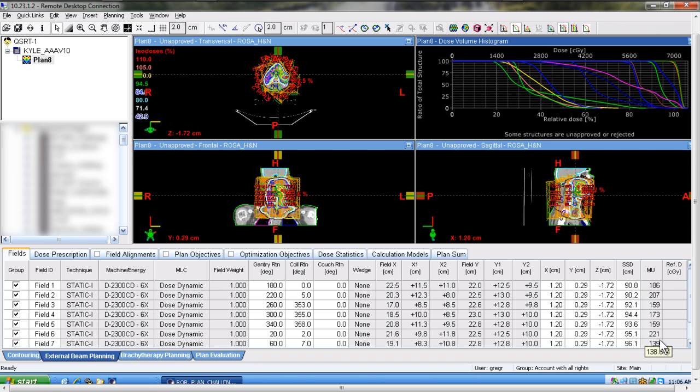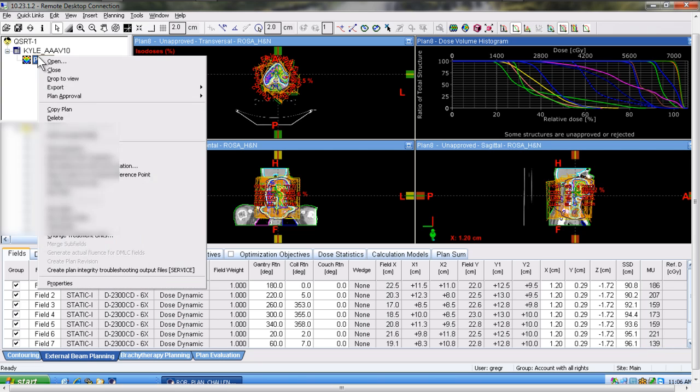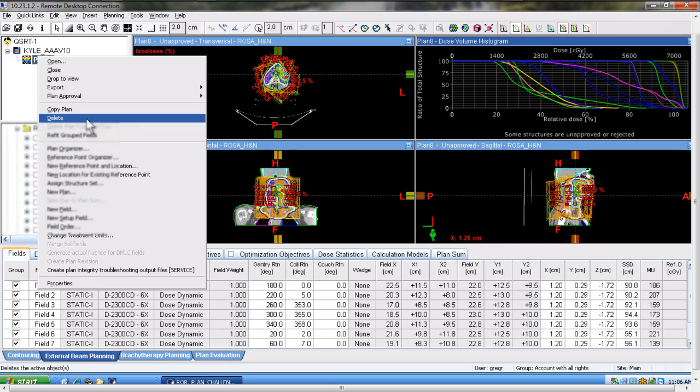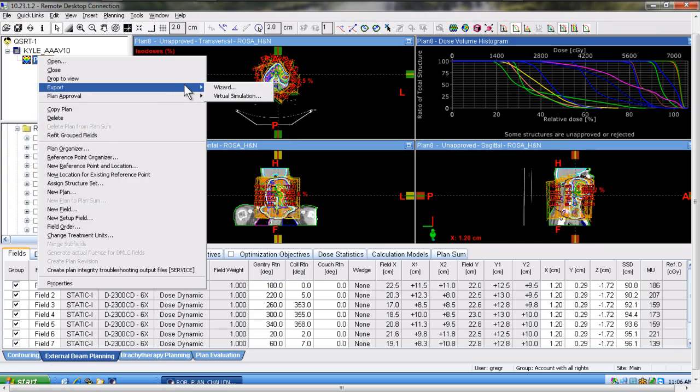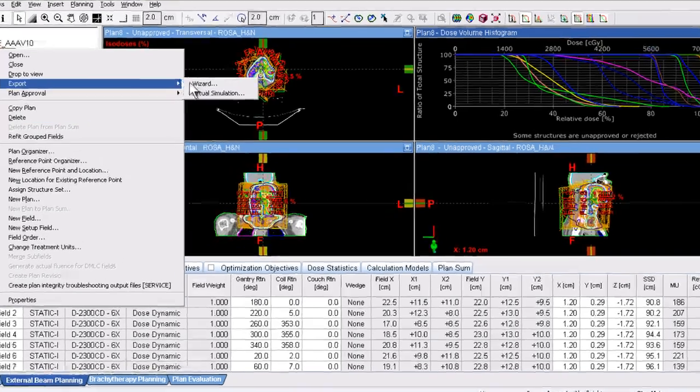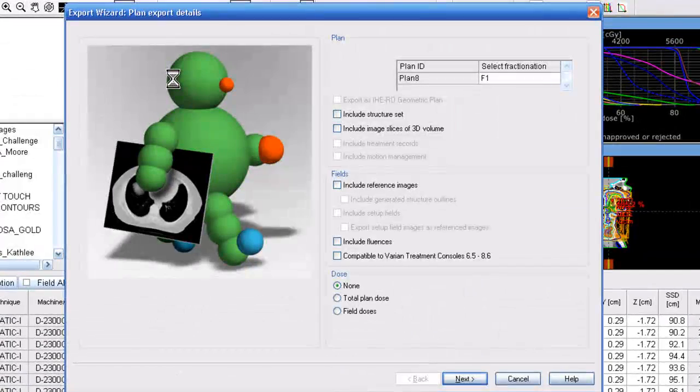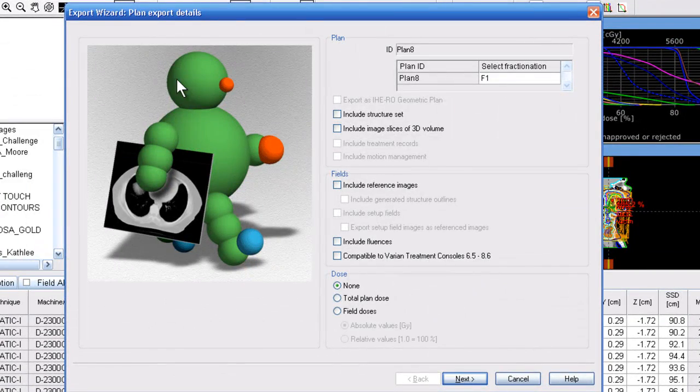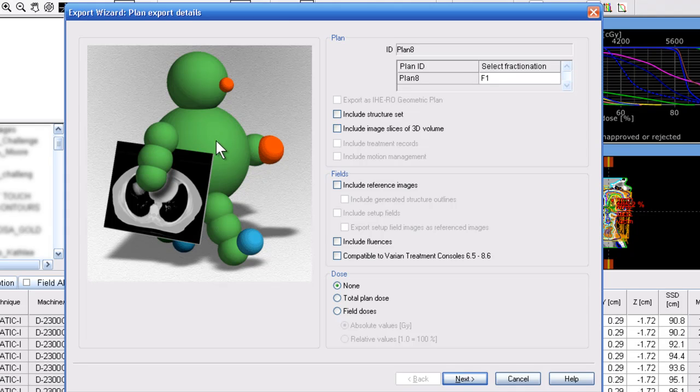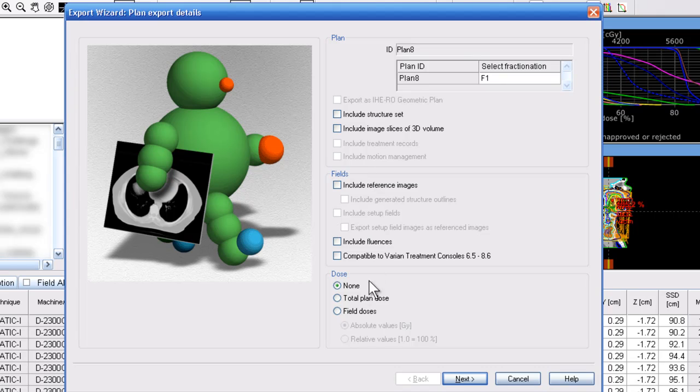Once you have the plan up in Eclipse and ready for export, you simply will just right mouse click on the plan, select export wizard. One of the changes that we have made recently is that we do not need the structure set or the 3D slices.